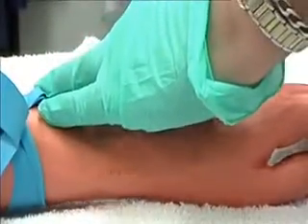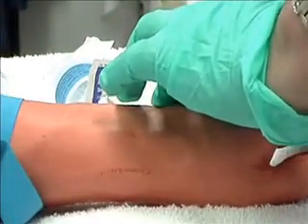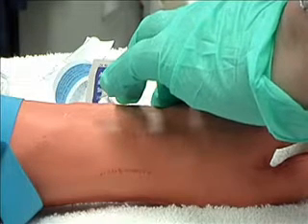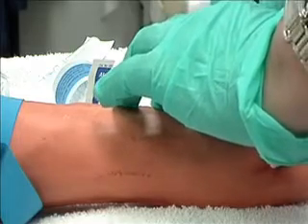Stabilize the cannula with one hand and release tourniquet with the other. Apply gentle pressure with the middle finger of non-dominant hand one and a fourth inches above insertion site. Keep cannula stable with index finger and remove the stylet, placing it directly into sharps container.